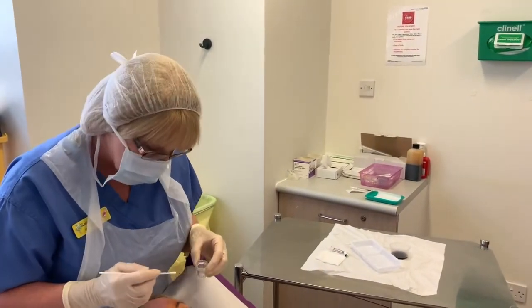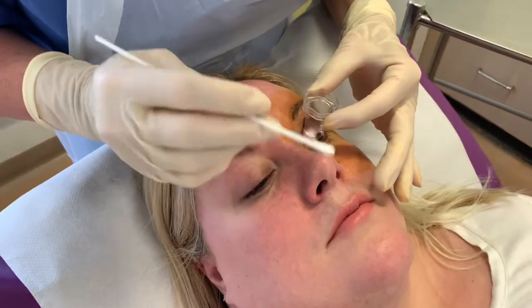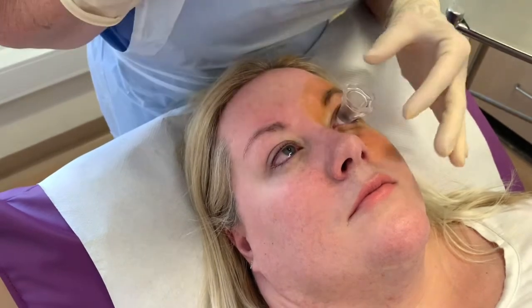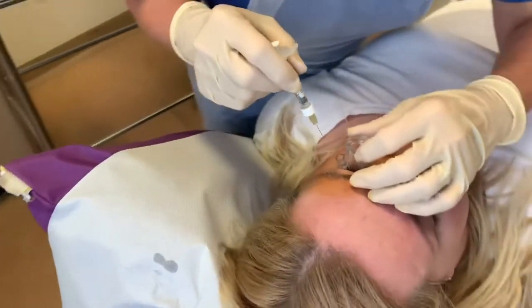Okay, ready, Charlotte? So if you look down to your toes as far as you can go again. Lovely. So the Invitria goes under the top lid, pull out the bottom lid, and then get the patient to look at me, and then just release it. Breathing exercise is always good, because it makes them relax and think about other things.